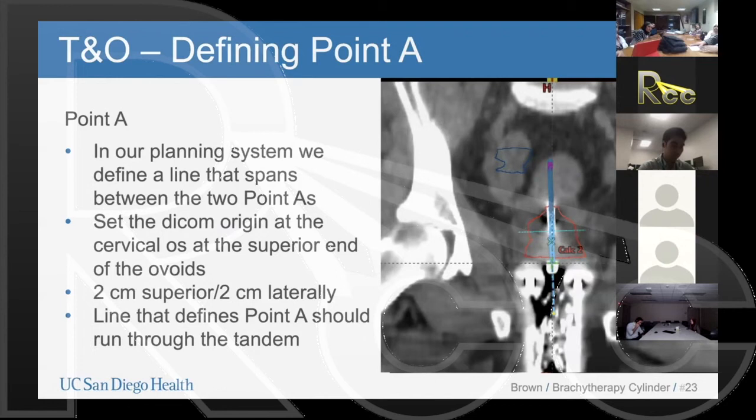Okay. No, I think you're absolutely right. As you change your window level, especially since it looks like you're using a metal applicator, it causes that to really bloom and appear bigger than what it truly is in real life. Dimensionally, it might actually grow by a millimeter or so. And then if you always digitize from the tip of the applicator, if that wasn't part of your commissioning process, you may introduce a systematic offset.